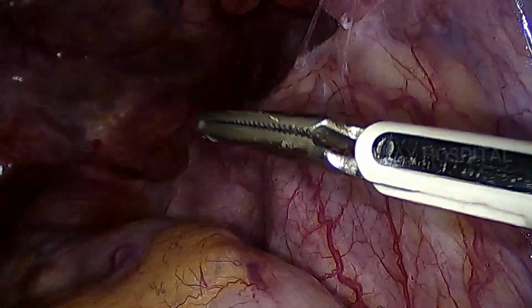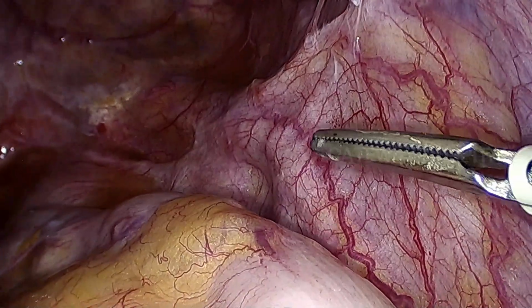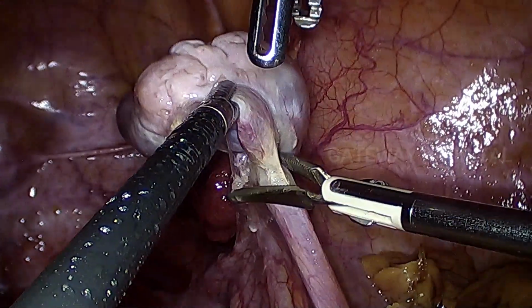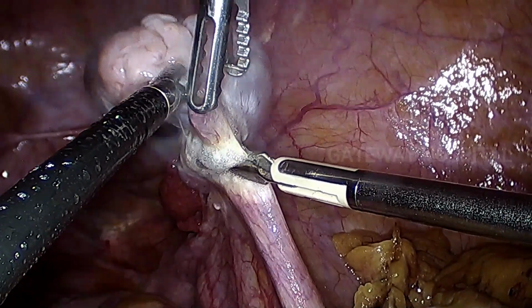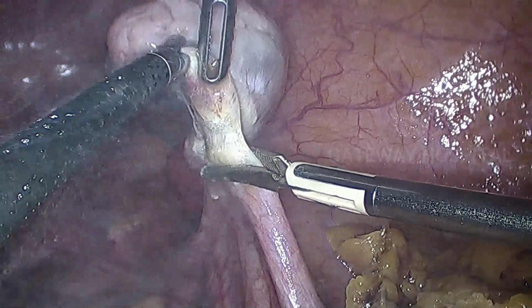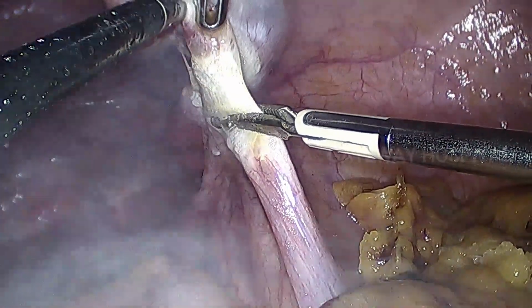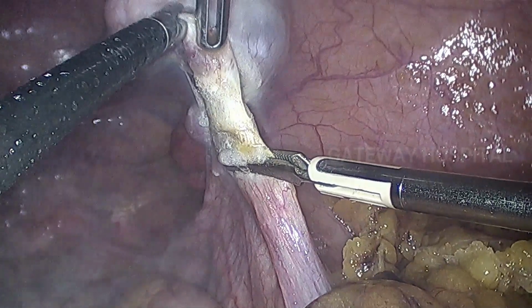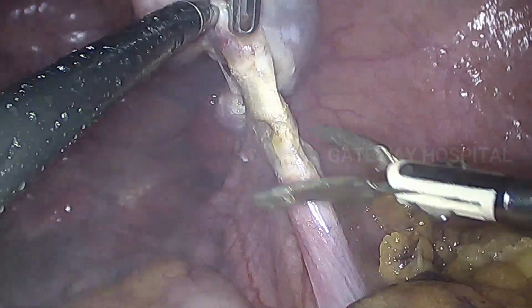While doing oophorectomy, you have to stretch the infundibulopelvic ligament nicely. You have to bring the pedicle more medially away from the lateral pelvic wall so that there will not be any injury to the structures like a vessel or ureter.